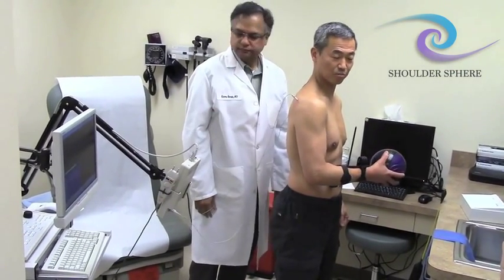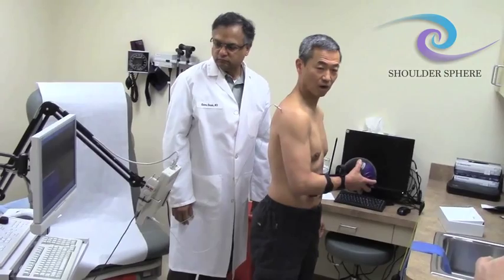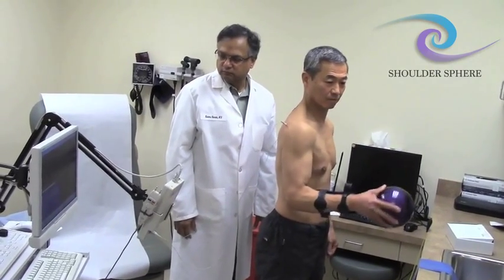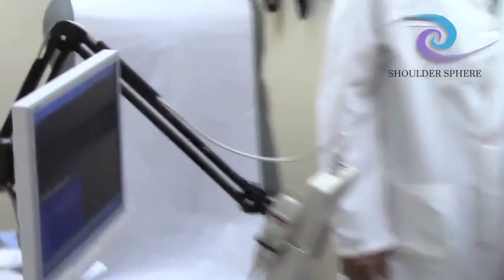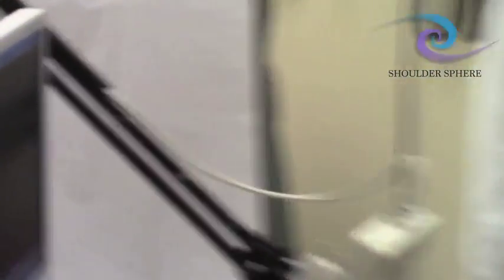This is a movement of the arm without the rubber band, but now I'm going to move along with the spinning rotation — the dynamic move of the shoulder sphere. You can see the rapid firing, activation and deactivation. And now I'm going to do the diagonal active movement.